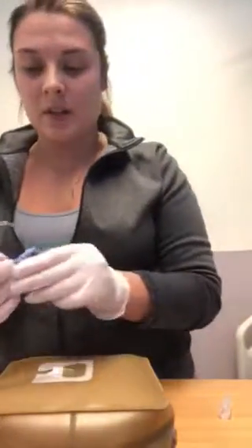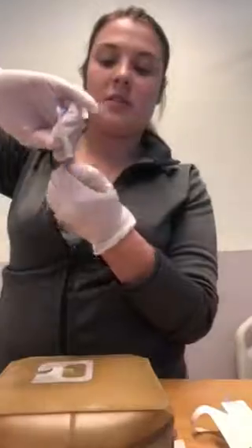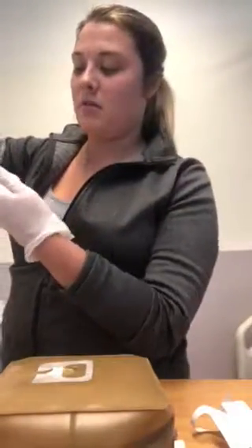Okay, at this point I'm going to connect my tubing. I know that I have morphine here, so I'm just going to be careful I'm not spilling. And I'm going to connect. Okay, so at this point I am happy with where my catheter is. It's in place.